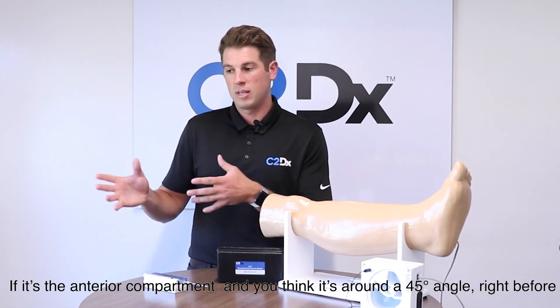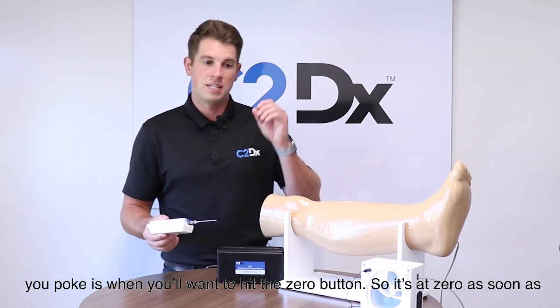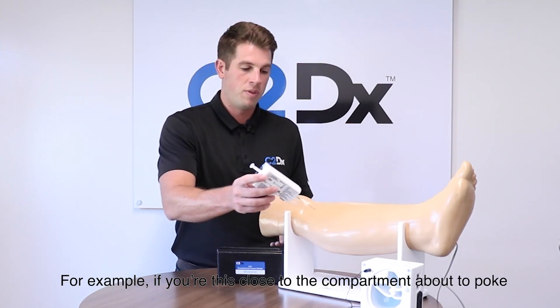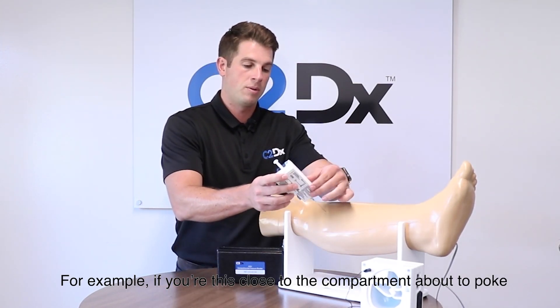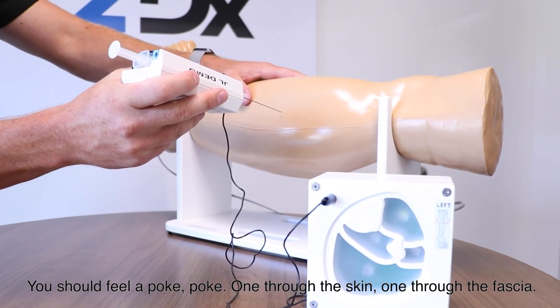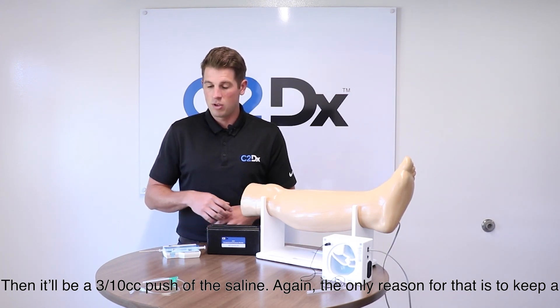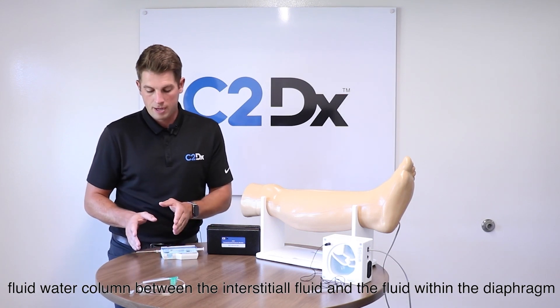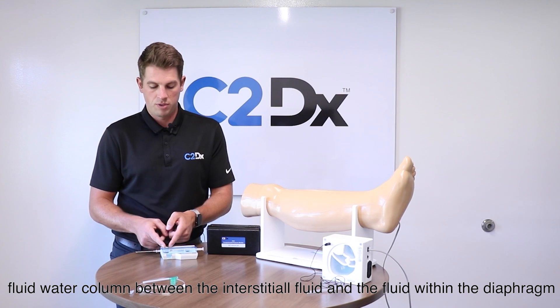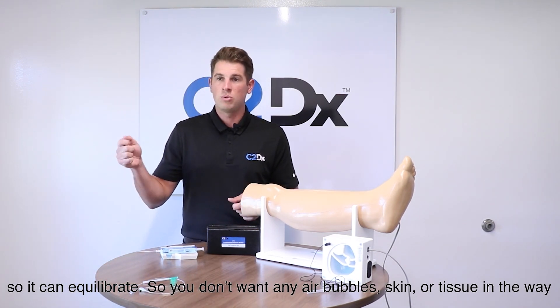Once you identify where you're going to insert — for example the anterior compartment — at about a 45-degree angle, right before you poke is when you hit the zero button. So as you're about to go into the compartment, you feel one poke through the skin and one through the fascia, then do a 3/10 cc push of saline. The reason for that is to maintain a fluid water column between the interstitial fluid and the fluid within your diaphragm so they can equilibrate. You don't want any air bubbles or tissue blocking the needle bevel.